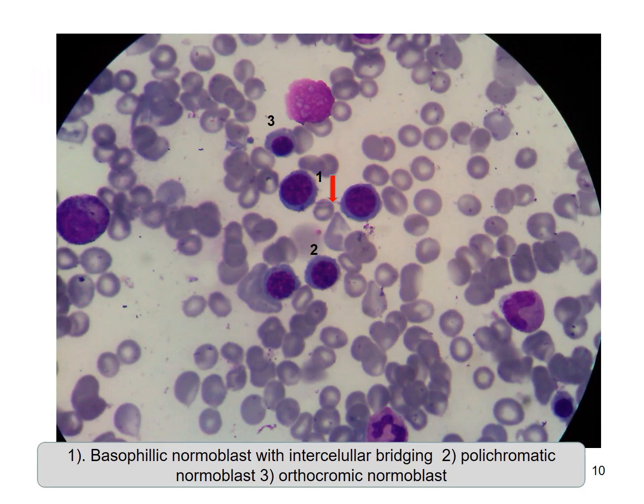We can see number 1 is the basophilic normoblast, number 2 is the polychromatophilic normoblast, and number 3 is the orthochromic normoblast. The red arrow shows internuclear bridging between basophilic normoblasts, which is commonly found in MDS.